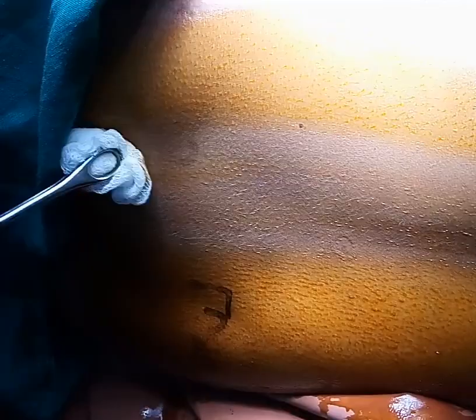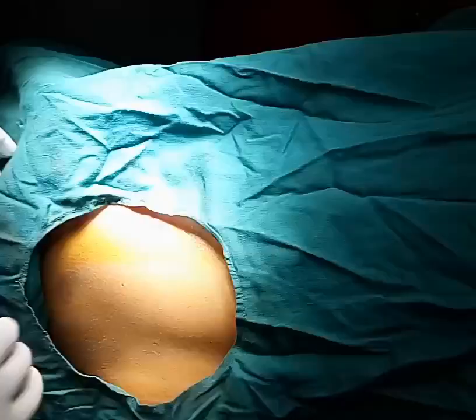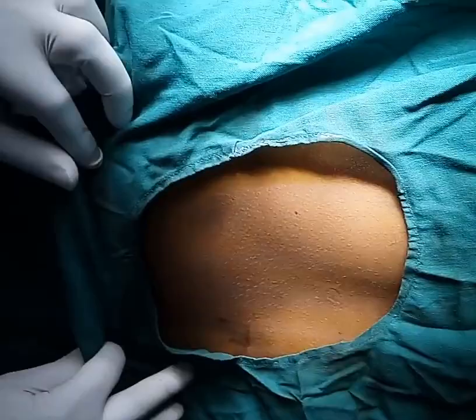I use betadine spirit and then dry gauze. You can see here the patient is not flexed too much — the legs are extended, just laying comfortably in the lateral position. Then you can see the needle entry point — it is one centimeter medial and caudal to the posterior superior iliac spine.